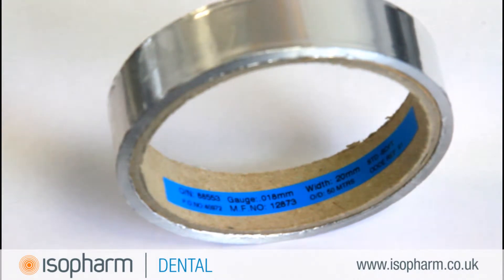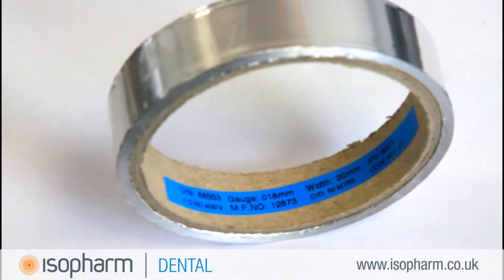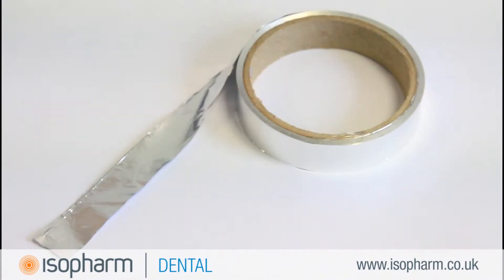The aluminium foil reel from Isofarm is manufactured specifically for testing to HTM and CFPP. Testing relies on repetition, so when performing the aluminium foil test on an ultrasonic cleaner, the same gauge of foil should be used for consistency of test.